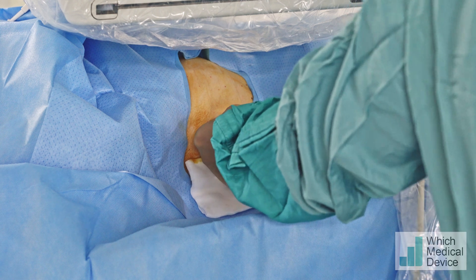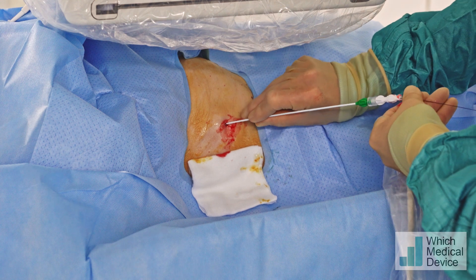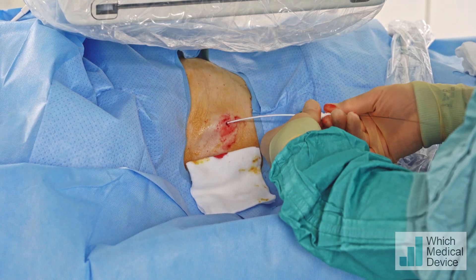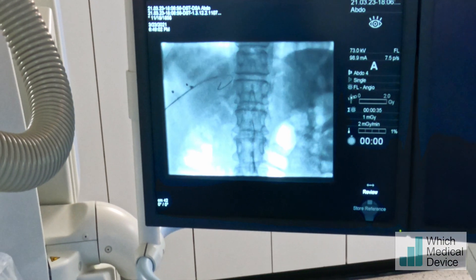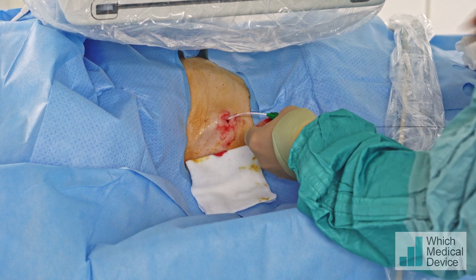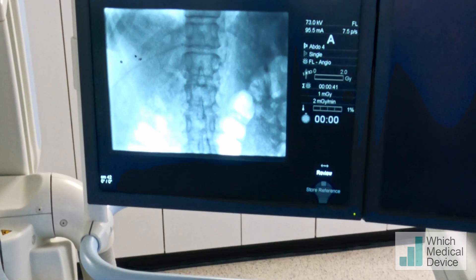I'm just going to pop that on the trolley. It's going to be some pushing — apologies if it's a little bit uncomfortable. We're just going to advance that forward, and once we've got to that point we can loosen the metal bit and advance it further. That's gone into the portal vein. I'm going to leave the outer bit there and leave the guide wire in to check. We've got flow back and we're getting venous blood — we can take the guide wire out, put some contrast in, check position, and then manipulate this down into the main part of the portal vein.